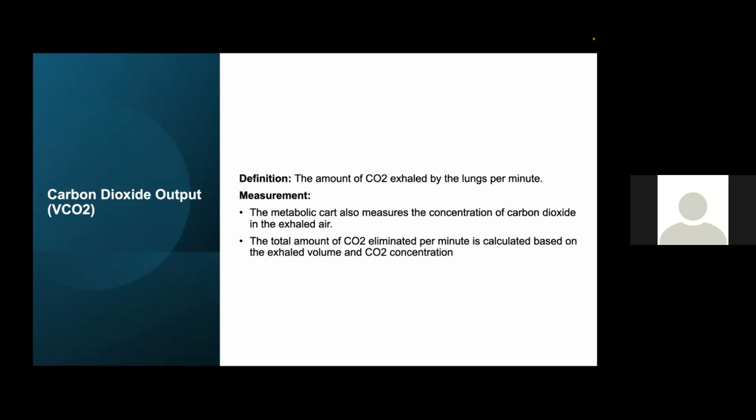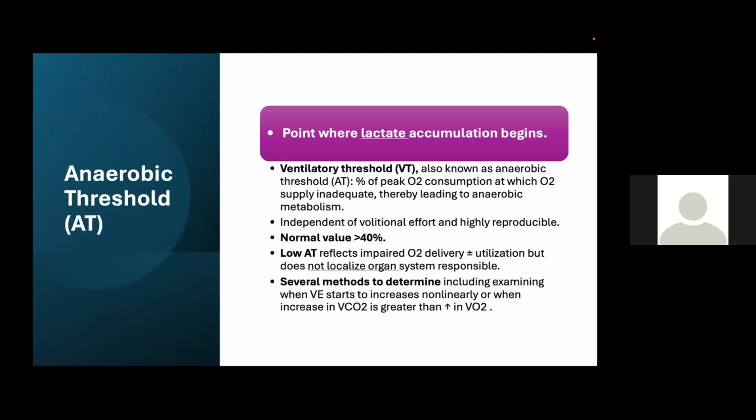Also, we have the carbon dioxide output. It's the amount of CO2 exhaled by the lung per minute, and it's measured by the CPET through the mouthpiece. They can measure the concentration of carbon dioxide, and it will be calculated in the tables.